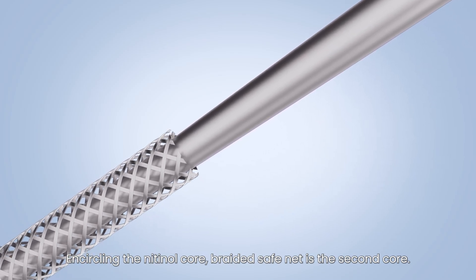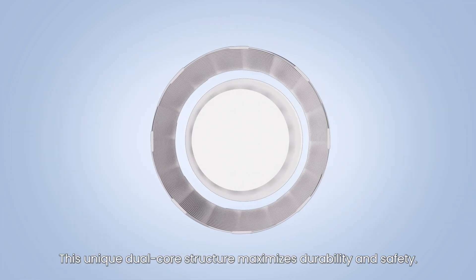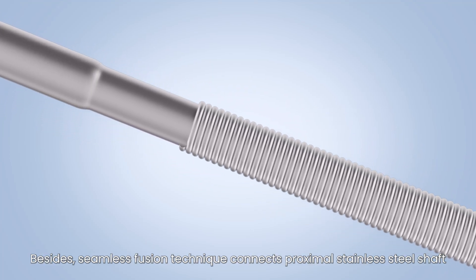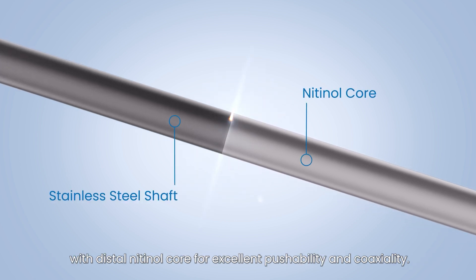Encircling the nitinol core, a braided safe net is the second core. This unique dual core structure maximizes durability and safety. Besides, seamless fusion technique connects the proximal stainless steel shaft with the distal nitinol core for excellent pushability and coaxiality.